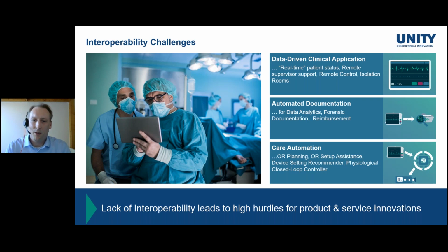And of course, all kinds of care automation, from semi-automated OR setups to physiological closed loop controllers to safety interlocks. Even though you can probably implement some of these use cases in other ways, all these use cases would benefit from medical device interoperability. And I want to introduce now the example that we will use along this webinar coming from the intensive care world.